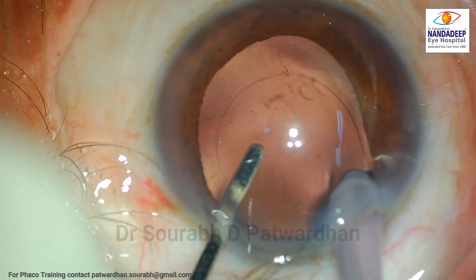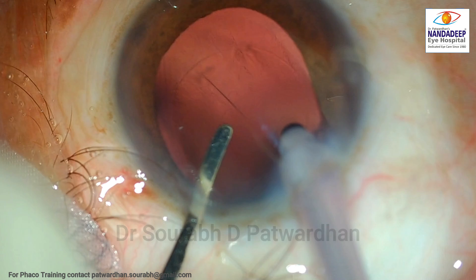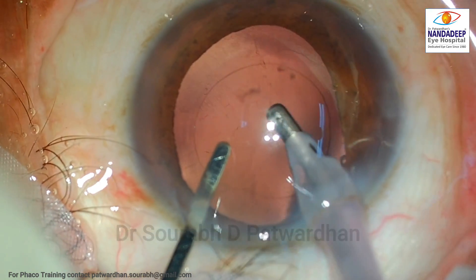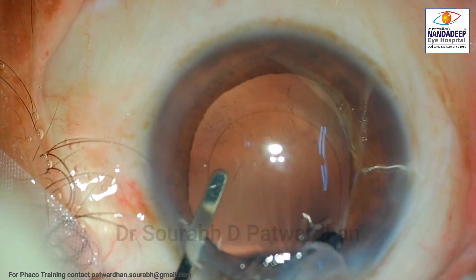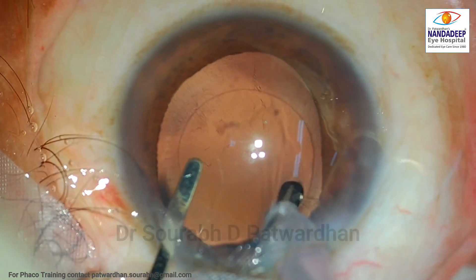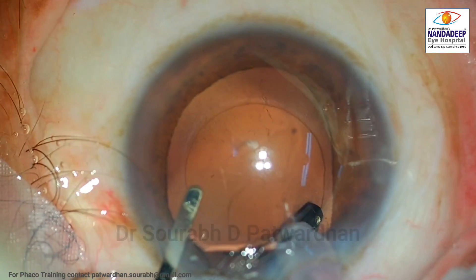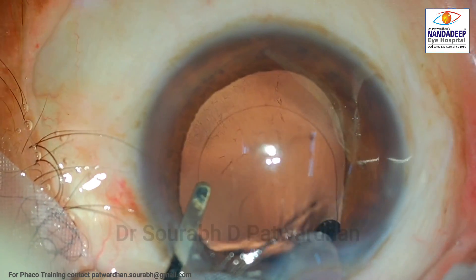Watch here — the IA probe is getting withdrawn into the incision, which is why the irrigation is being compressed. You can see lines on the posterior capsule indicating that the anterior chamber is getting shallow, and there is a higher risk of catching hold of the posterior capsule. Luckily the surgeon is now using low vacuum, understanding that the anterior chamber is unstable. The irrigation is still a little bit compromised but better than the previous attempt, and the surgeon could remove the sub-incisional cortex. It is important to prevent such issues, and they can be easily prevented with the steps shown.